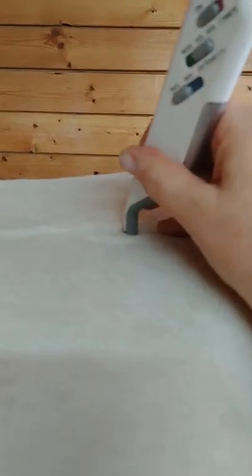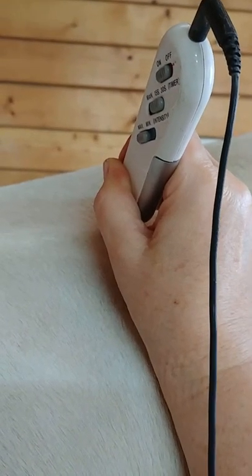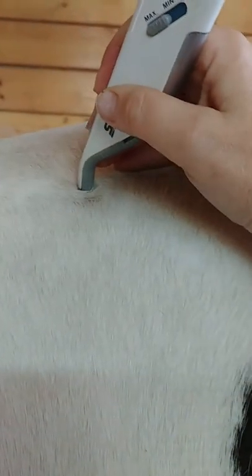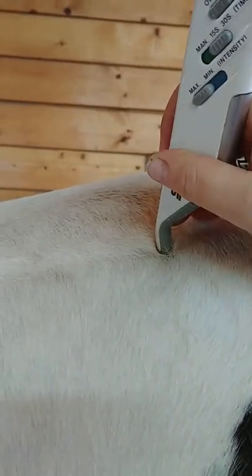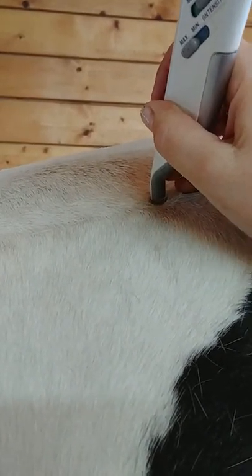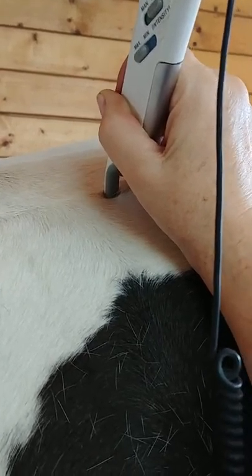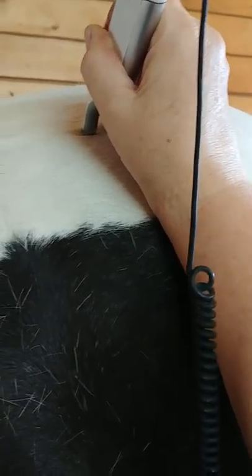I'm using this on him, and I should have the other end grounded by holding it with my hand, but I'm holding the phone. What I'm doing now is working my way along the bladder meridian. When it makes a noise, it's finding things, and when it's quiet, it means it's zapping — so I'm electrocuting his back end for him. You'll hit spots where the resonance drops. You would hear more of a change if I was able to hold the grounding with the other hand, but I don't have anybody to do the video as well as work on the horse. I just wanted to show you what I'm doing.